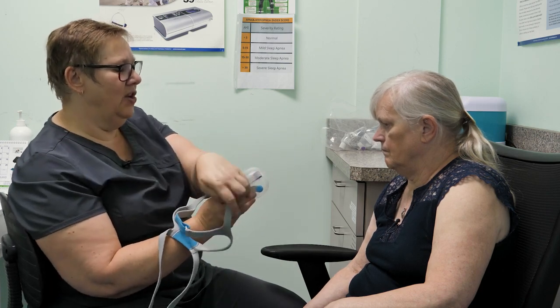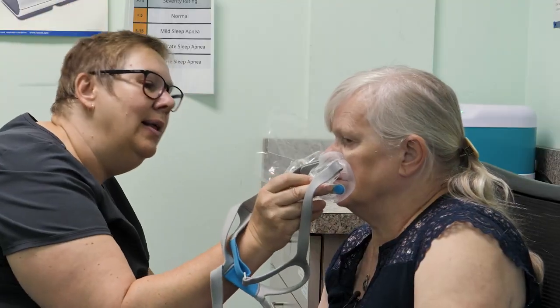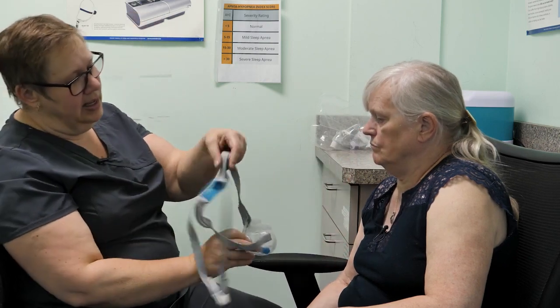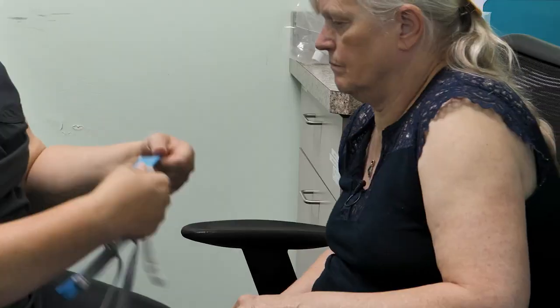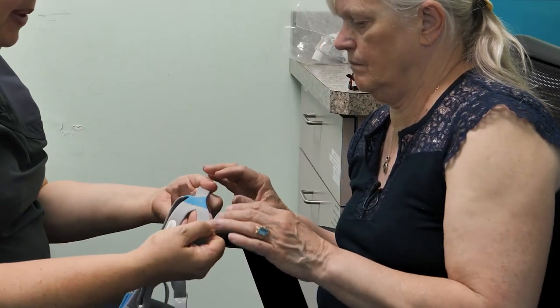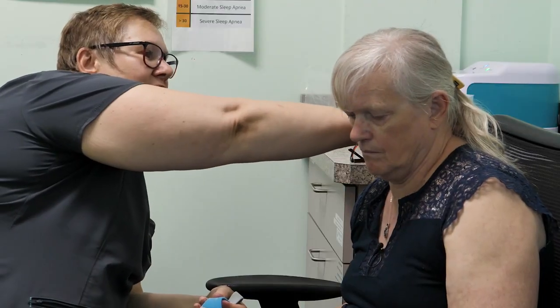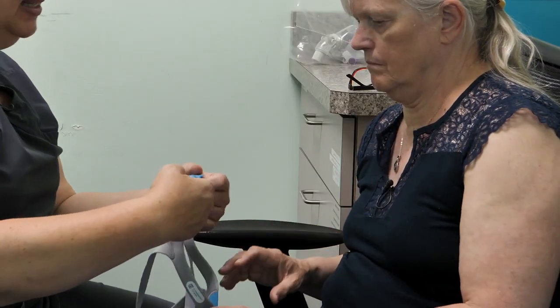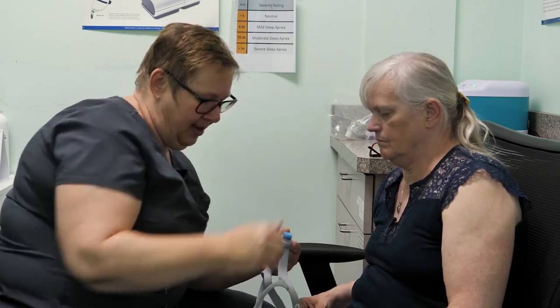So I'm just going to show you how it fits, okay? So it's just going to go like that. That's okay? Okay. So what we're going to do is I'm going to show you how to put on headgear. So you're going to take the headgear from the base here. This part of the headgear at the bottom is going to sit at the base of your neck. So your ponytail might get in the way a little bit, but yeah, this is going to sit low at the base of your neck. This does not sit here on your head. It's sitting a little bit farther back, all right?